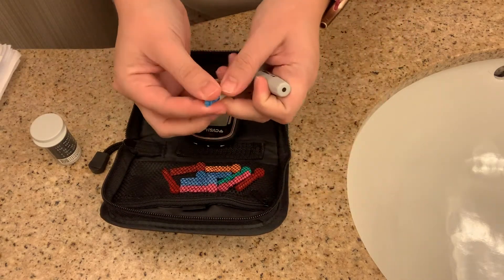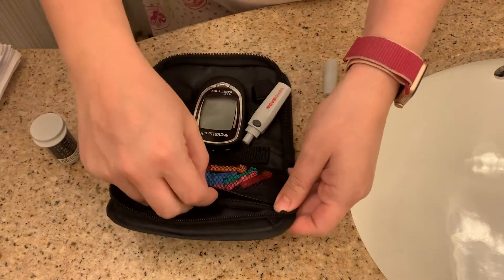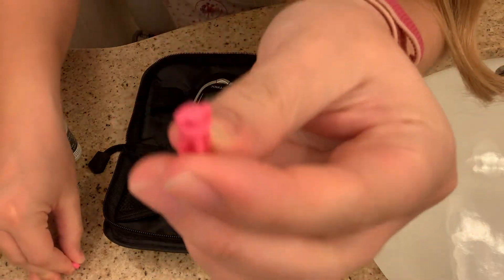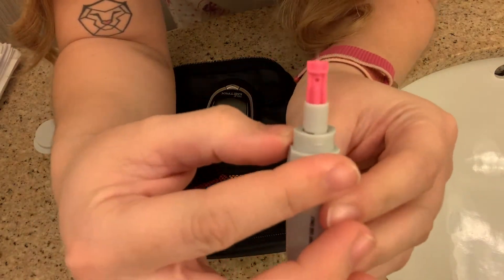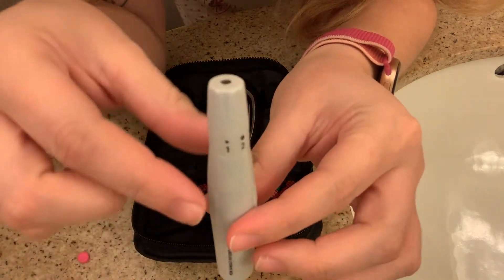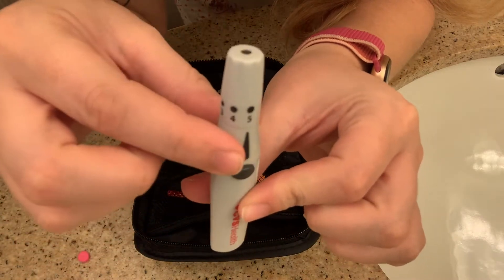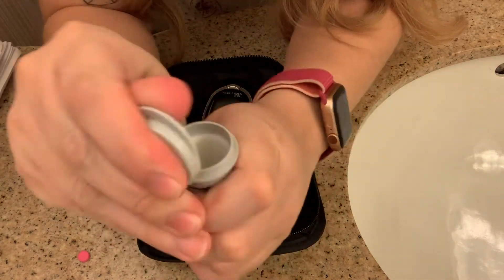I personally change my lancet every single day. Some people change it every use and some never change it, so every day felt like a good middle ground for me. The reason you want to change it often is so it stays nice and sharp to get a good drop of blood. The numbers around the pen go from one through five and I always keep it at five because it's the strongest — if you're going to prick your finger anyway, you want it to be fast and efficient with a good drop of blood.